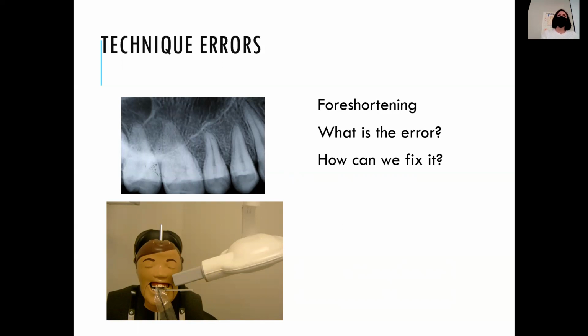If they've foreshortened the images, they are too steep. And so what's happening is, and I have a picture. I'm going to see if I can draw it here on the doc cam, because I think I can make an image drawn a little bit better than trying to explain it.